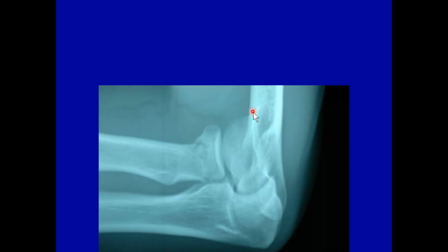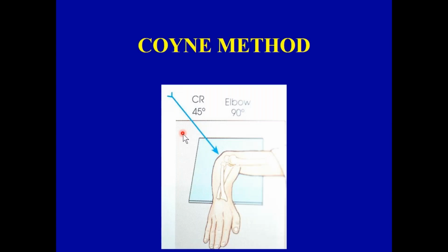Another example, a lateral examination. There shouldn't be this much superimposition of the humeral, the epicondyles of the humerus, but it doesn't matter. There's a fracture that we can tell the doctor about, and it is achievable or reasonable to get a highly diagnostic film on the digital systems. Conventional X-ray, if you can tilt your tube, so you can do that.